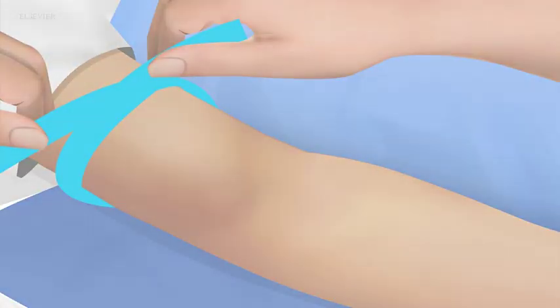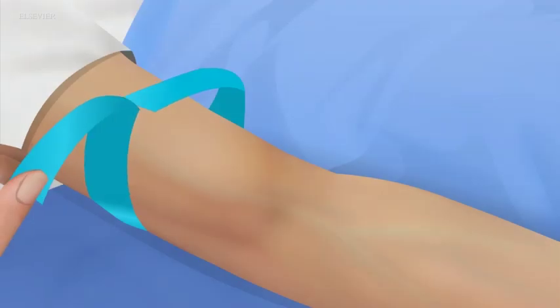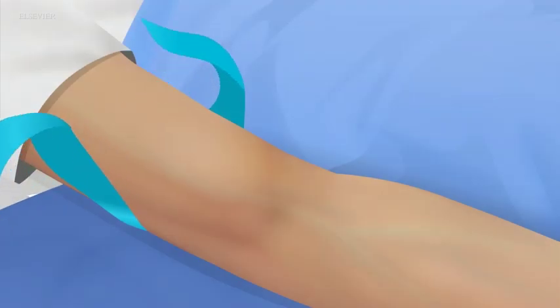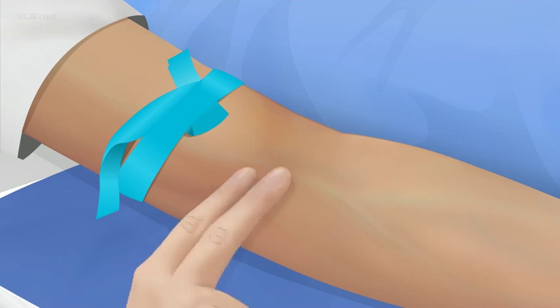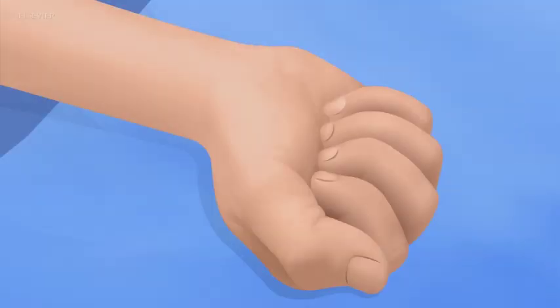If a tourniquet is deemed necessary, apply a single-use tourniquet 4 to 5 finger widths above the selected venipuncture site. Do not keep the tourniquet on the patient longer than 1 minute. Palpate the selected vein for firmness and rebound. Instruct the patient to make a fist without vigorously opening and closing the fist.